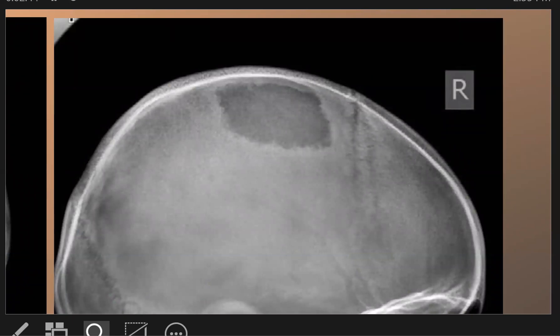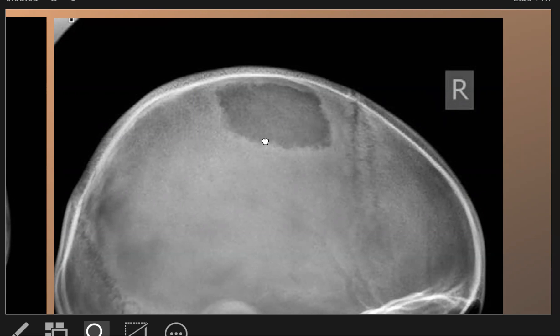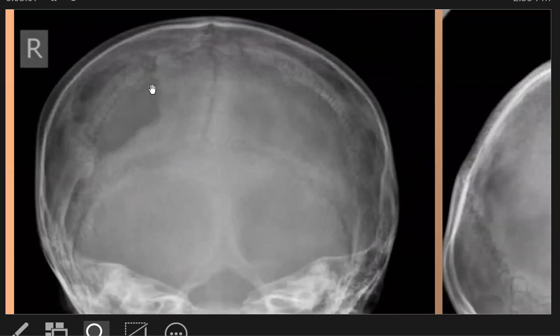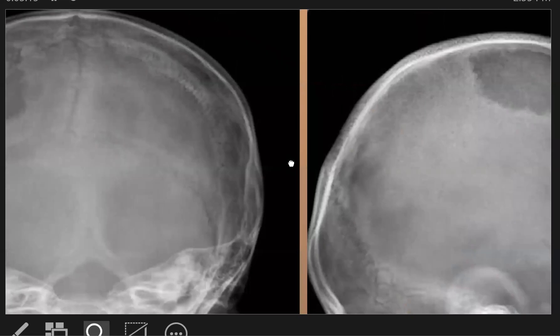What is a beveled lesion? A beveled lesion is where we see the two edges of the skull — the outer and the inner table — are not at the same level, as we see in the lateral view and also on the Towne's view. You see here one edge and another edge, and this is called the beveled appearance.